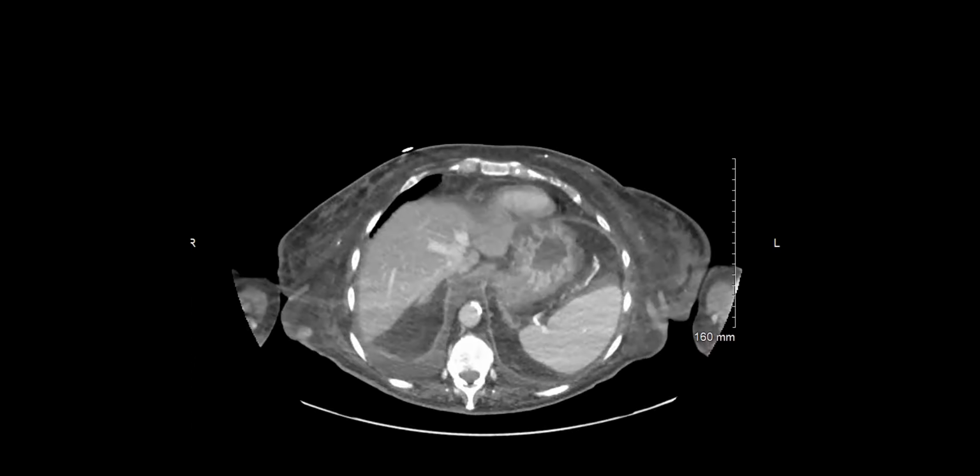Oh, arrow sign. Bladder mass? Yes, I mean, it's not an eye test. And for me, what was interesting is the pathology. So this one came back as mucinous and enteric subtype of bladder cancer. Oh, that's so cool. Yeah, and it's very rare.